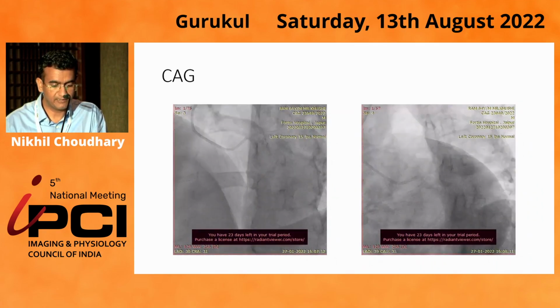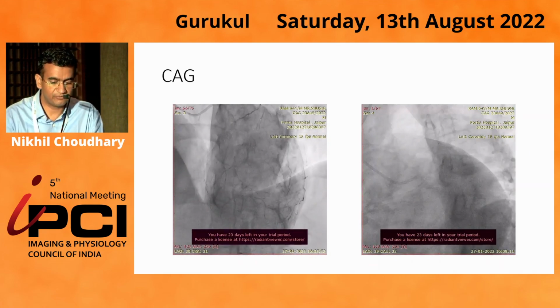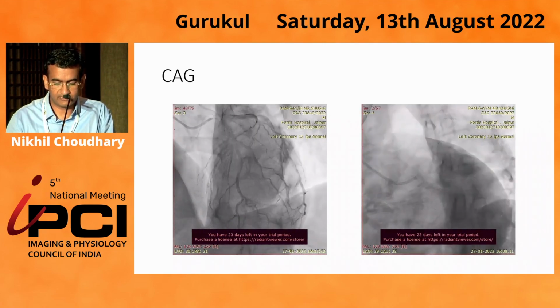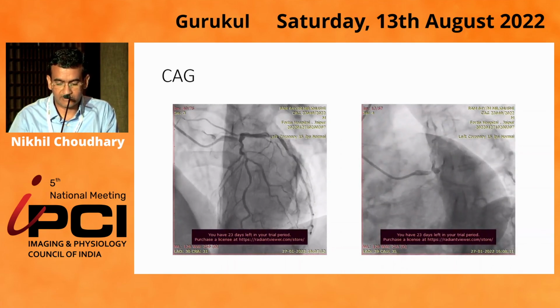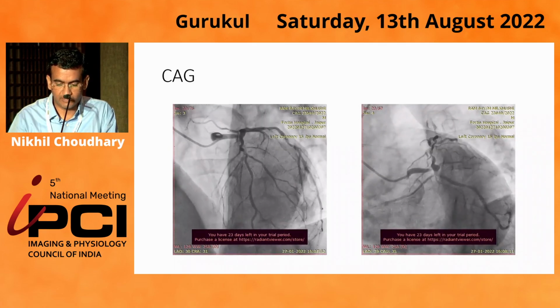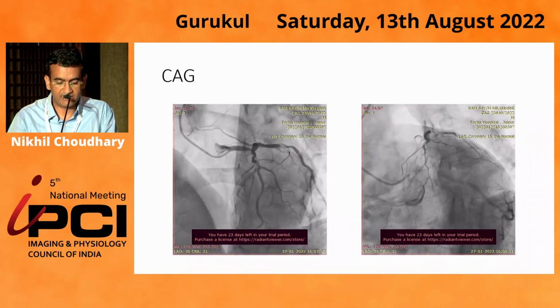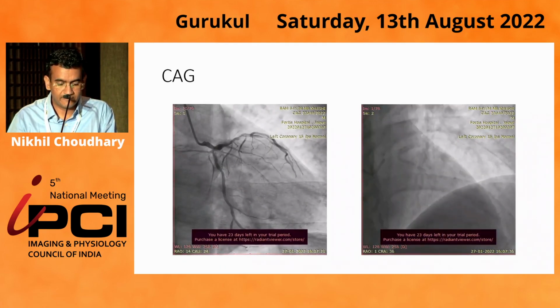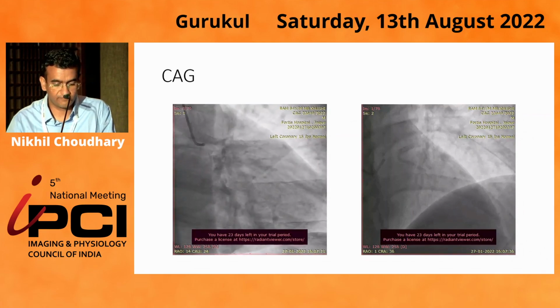PDPLV showed mild plaquing. This is what his left system looked like: tight stenosis at the distal left main. This patient came to me with this CD, and looking at the distal left main, I thought there was some aneurysm at the crux or the carina. Heavily calcified and very tortuous LAD. The proximal LCX was stented previously and it was flowing well.